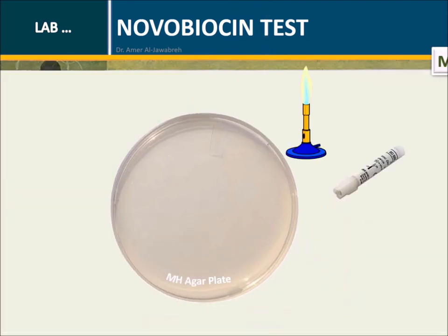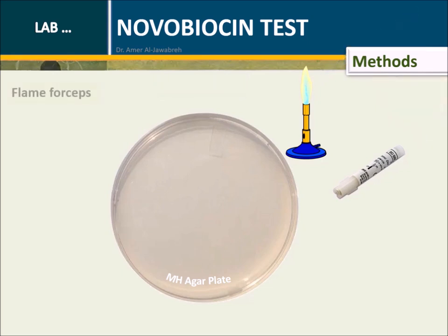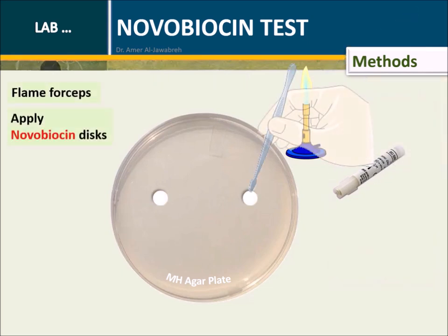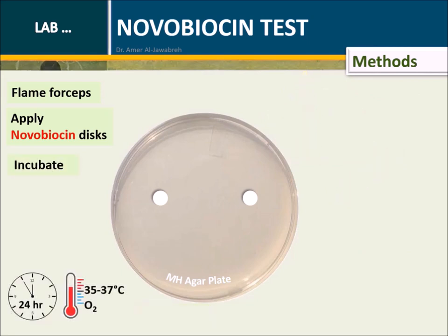Methods: Under aseptic technique, apply two discs of 5-microgram Novobiocin and press gently. Incubate aerobically at 35 to 37 degrees centigrade for 24 hours.